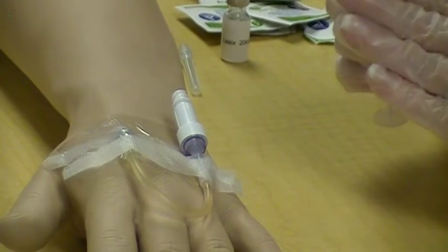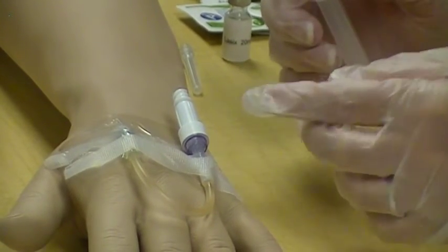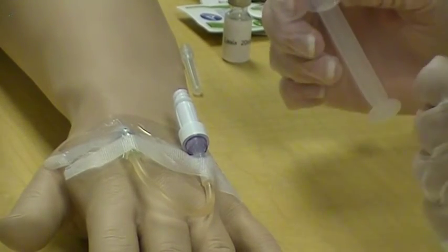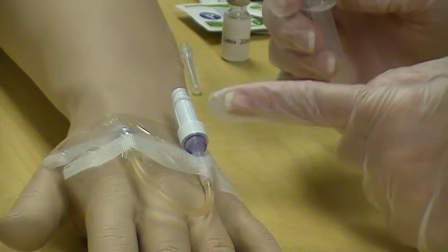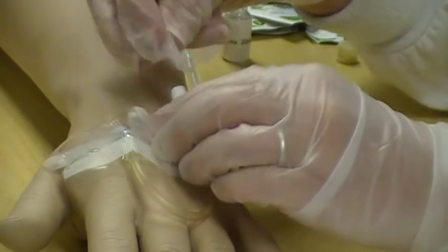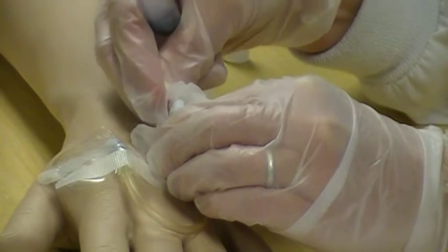The reason behind this second saline flush is because when we ended our push, we still have medication in the tubing. We want the patient to get the full amount of medication. Therefore, we need to flush it with some saline in order to push the rest of that medication on into that venous system. So again, we're going to clean. We clean anytime we are getting ready to attach anything to the saline lock, 5 seconds.